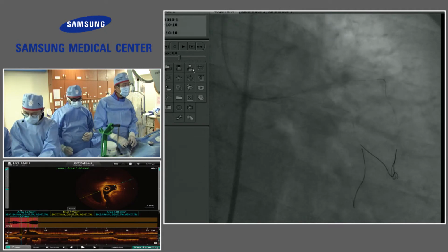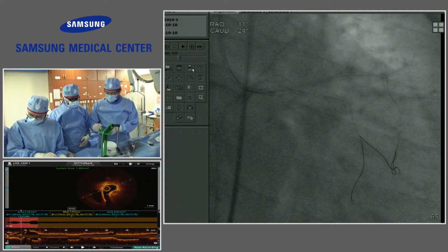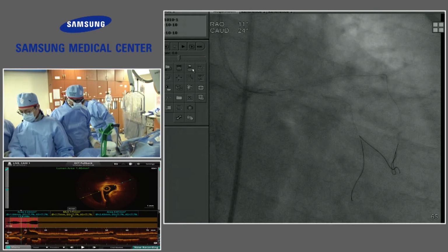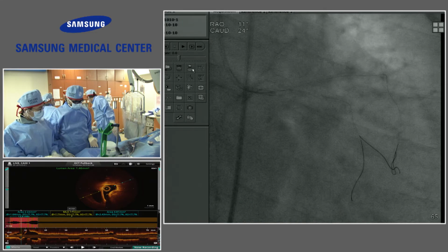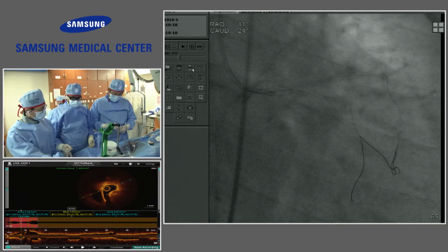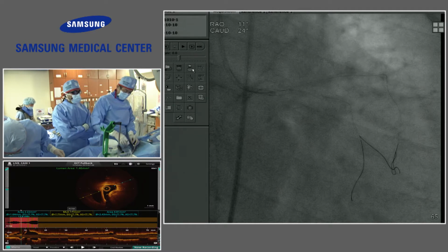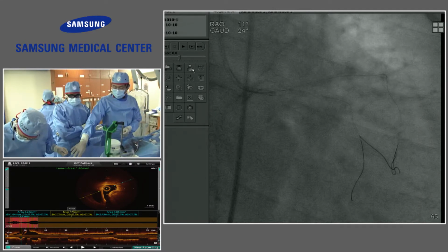So with that extent of calcification, and when you talked in your initial strategy about how to prepare the lesion, decalcification, thinking about rotational atherectomy, since the extent of calcification is not really circular, when you do rotational atherectomy, obviously you can't protect the other branches. Would, for example, shockwave be an option? You could wire all 3 and then try to see whether shockwave would do something to the calcium?